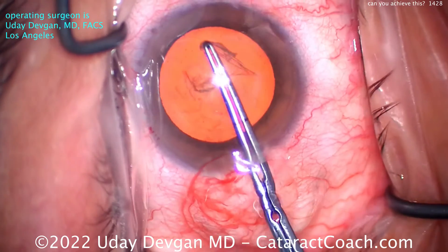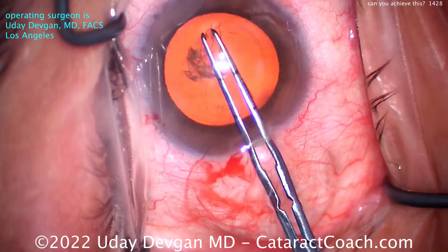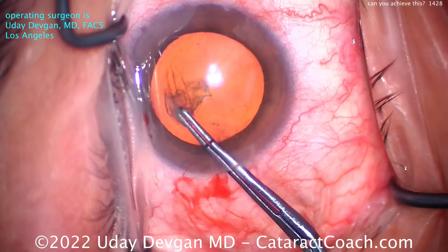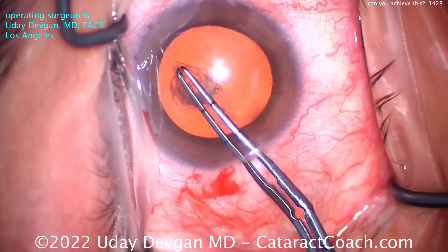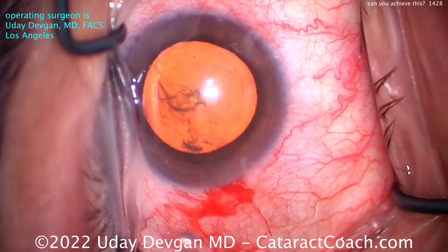Now notice how the beginning steps I was a little more efficient, but now for a critically important step like a capsulorrhexis, I'll take my time. I'll grab the capsule as many times as I need to really get a nice result there at the end, because that's a critical step of the surgery.